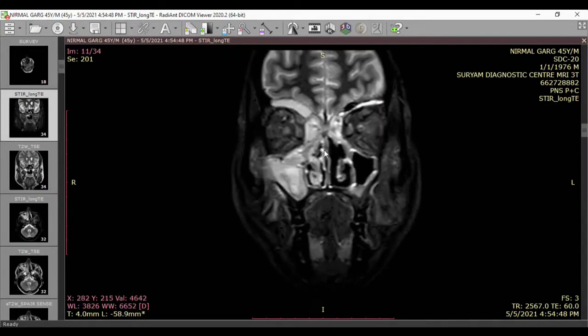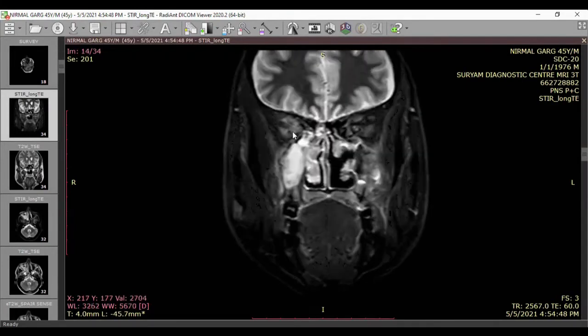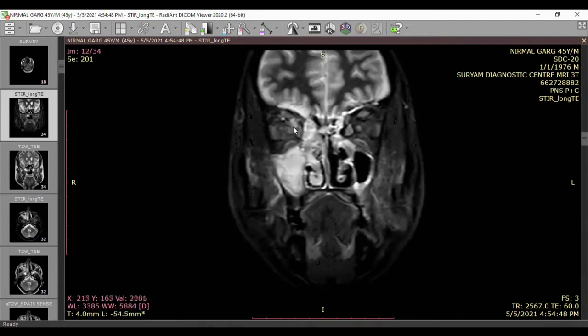See, this was the sinusitis and had infarct of the right optic nerve. In fact, very limited disease in the orbit. This one had infarct in the optic nerve. The infarct is best picked up by diffusion, and diffusion will tell you that this vision is not going to come back once infarct has involved the optic nerve. Optic nerve infarcts are irreversible.